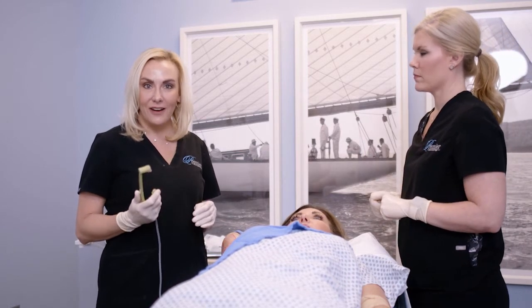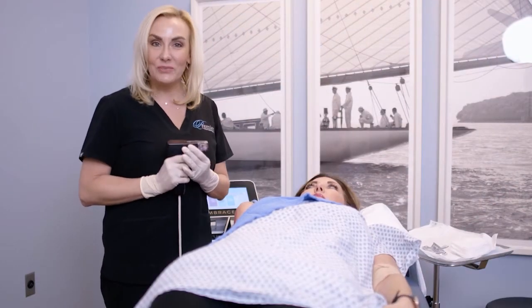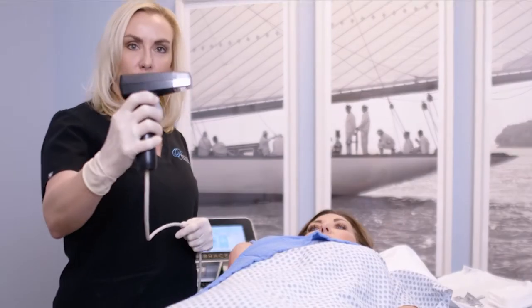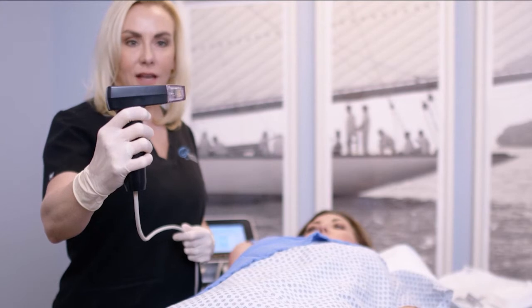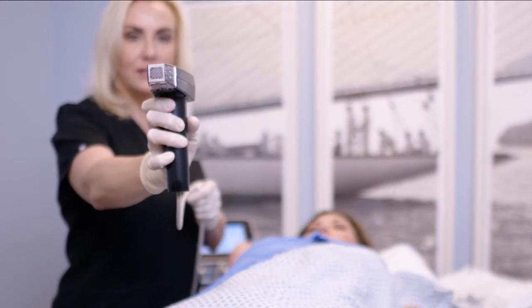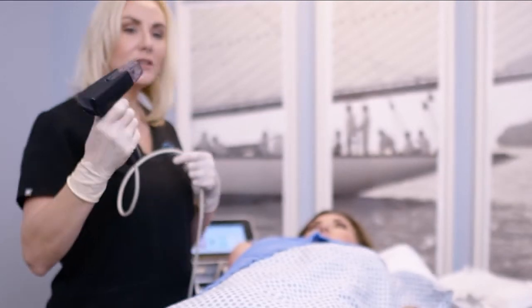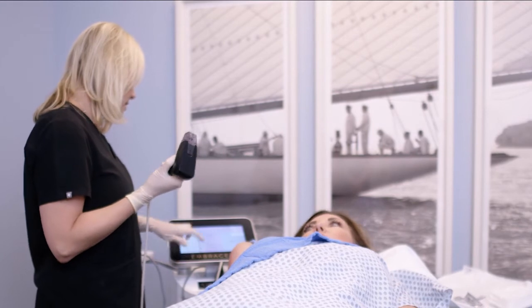So now we're going to clean off, we're going to switch gears, and I'm going to show you how the Morpheus procedure works. Now we're going to do the Morpheus portion of the treatment. This is our Morpheus 8 handpiece. This is radiofrequency microneedling, and you can see that that's the piece that actually touches the skin. And I'm going to turn my settings on so you can actually see what the device does.